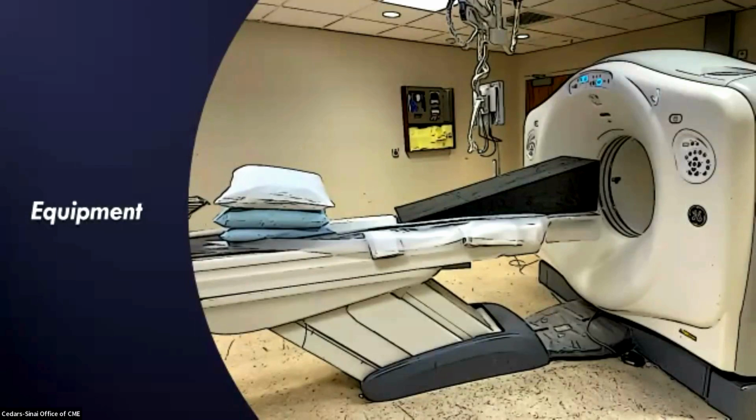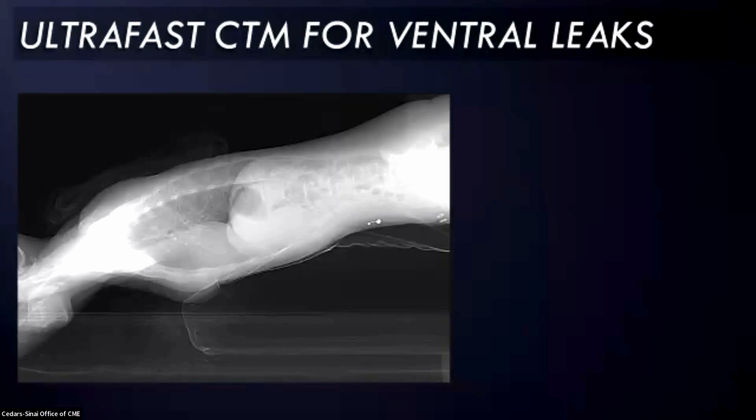So you need something to tilt the patient instead, and something like a foam wedge is typically what is used. This is what the patient looks like. This is a scout image with the patient on that wedge. You can see the wedge is this radiolucent structure beneath them, and it causes a slope in their spine, so that if you could imagine dropping a marble on the back of their vertebral column, it would roll all the way down towards their head.